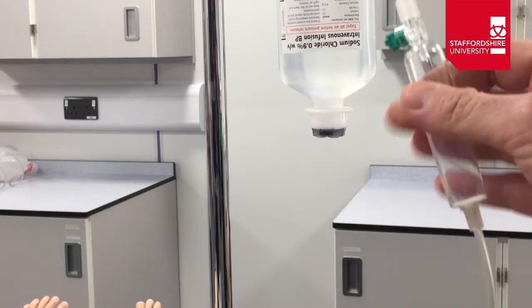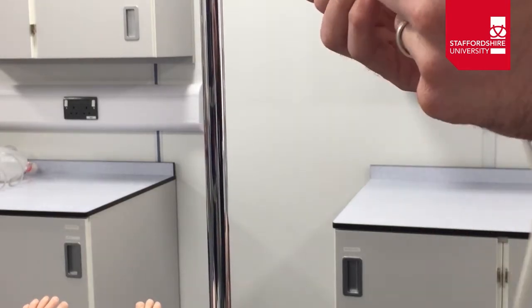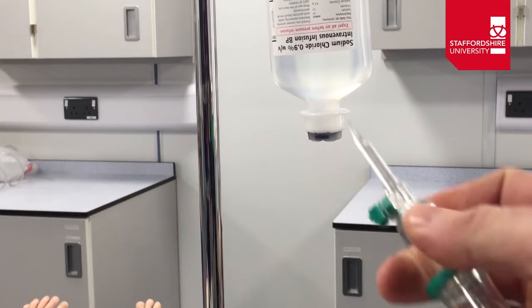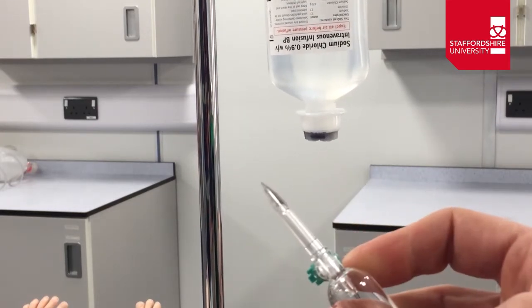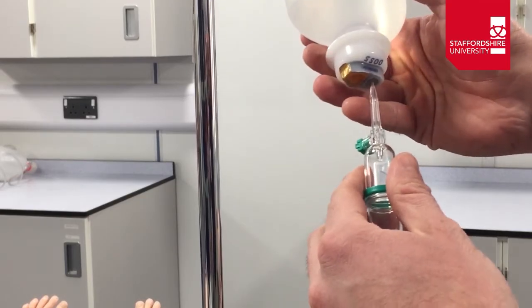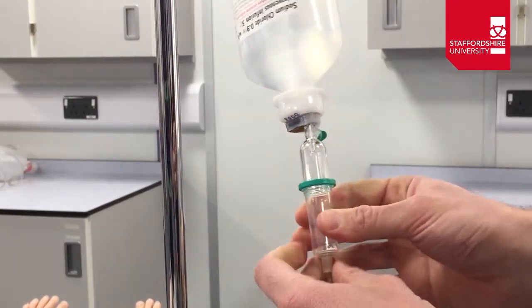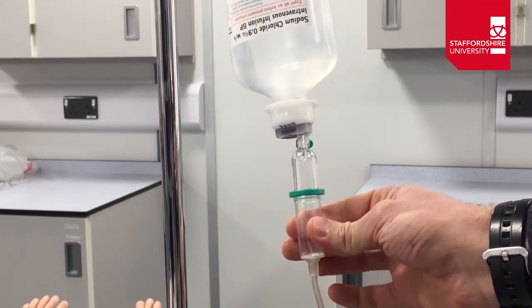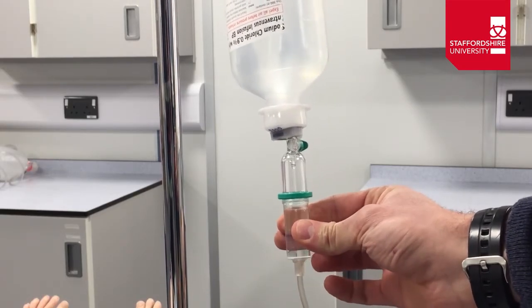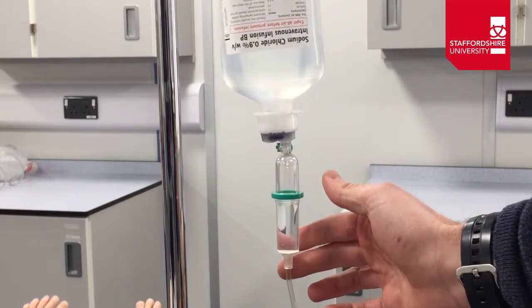We're going to remove the protective covers from the fluid bag and from the end of the giving set. It's important to be careful at this point as we now have active sharps in play. Insert the spike into the port with a twisting and pushing motion and you should see fluid come down into the chamber. Squeeze the chamber to fill it to around half full, which will allow you to see the drip rate once the line is open.